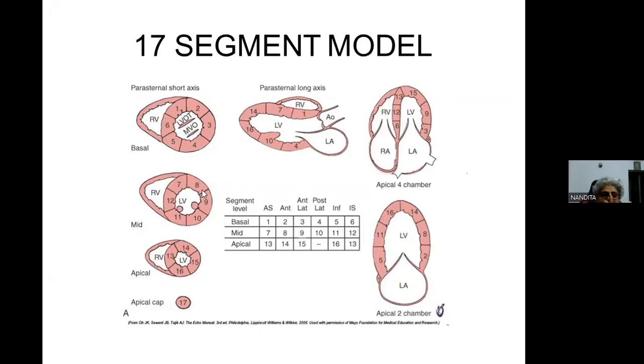Now, what do we have here? Let's see. We have the interventricular septum, correct? Yes. Now, at the anterior part, what is the supply normally? What is closest to it? It will be the septal branches from LAD. LAD, yes. And inferior, that will be from posterior. Right.